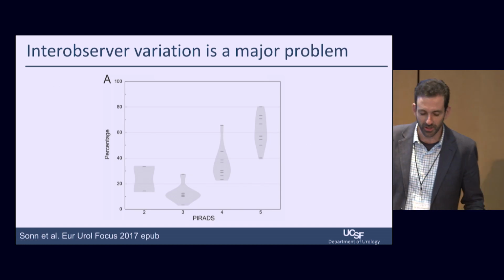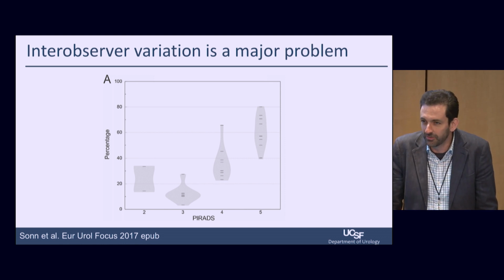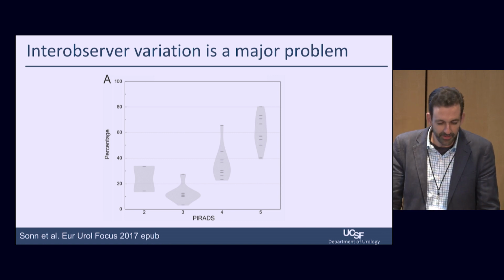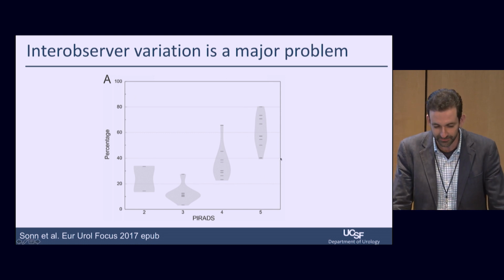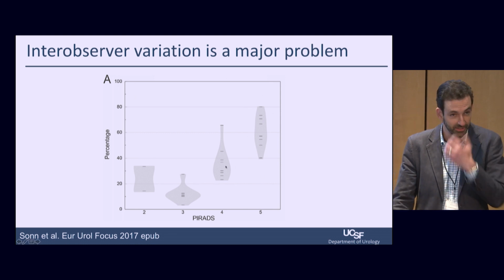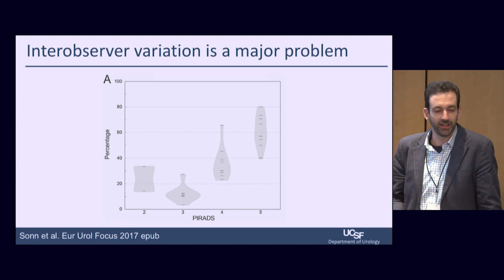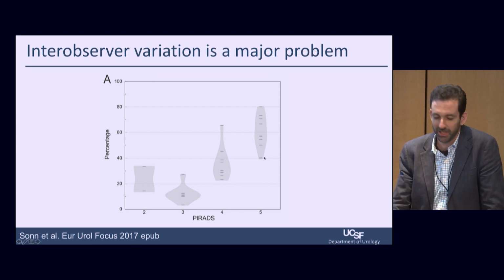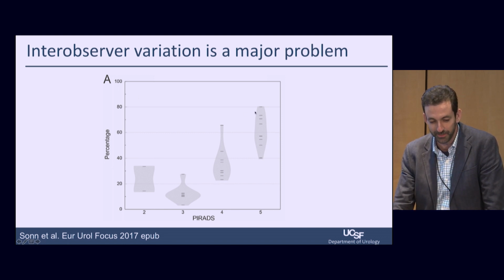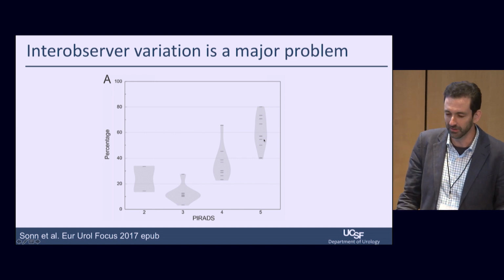And the other real issue with MRI that does not get talked about nearly often enough is interobserver variation. This is a study from Stanford, which is a good MRI center. They don't have quite the volume and experience that we do, but it's certainly a very good academic center. They looked at the individual radiologist calling out the MRs. And if you looked at the PIRADS 5 reads here, I'll show you PIRADS in a second, but PIRADS is basically a 1 to 5 grading system whereby PIRADS 5 is supposed to indicate a high confidence that we've got a high-grade cancer there. Well, the likelihood of finding a high-grade cancer on biopsy ranged from 40% to 80%, depending on which of these 9 radiologists read the scan. And that's a lot of variation within a single academic center.